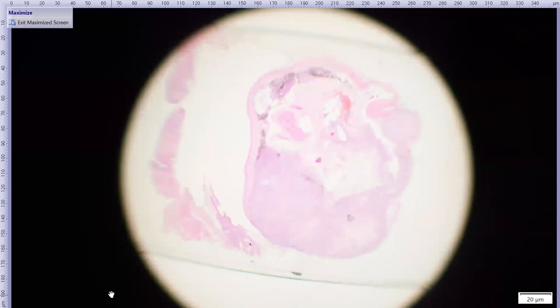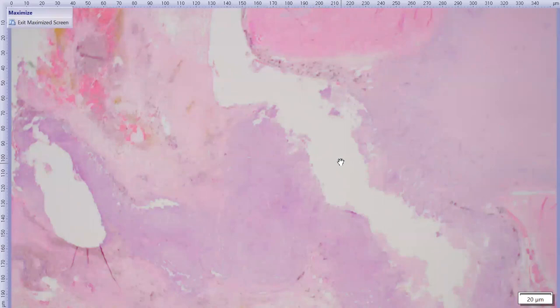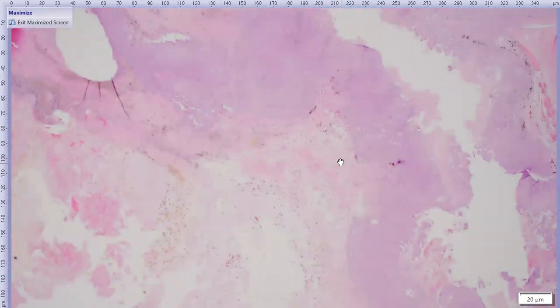All right, so here is our subgross. Again, we still have the lids attached here. And then here is the main portion of our mass that kind of flows out through the sclera on this side. You can still see a little bit more of it here. Got lens in the center and then some hemorrhage. And I'm pretty sure some of this is retina that's floating around back here. So let's come back up.